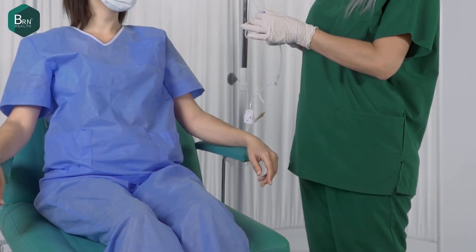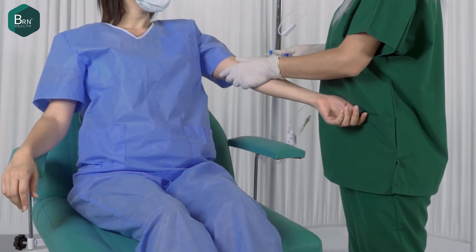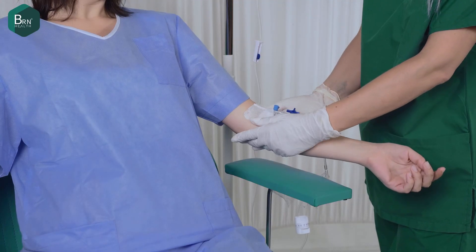The IV cannula with a one-way valve is attached to the patient's arm with plaster tape for intermittent and safe administration of the drug during the infusion.